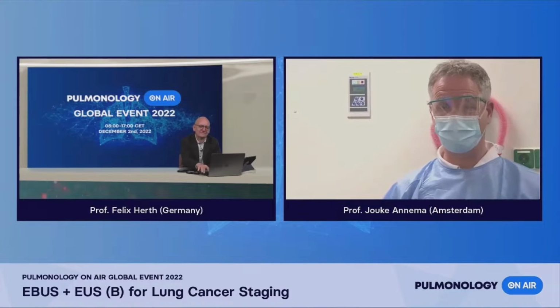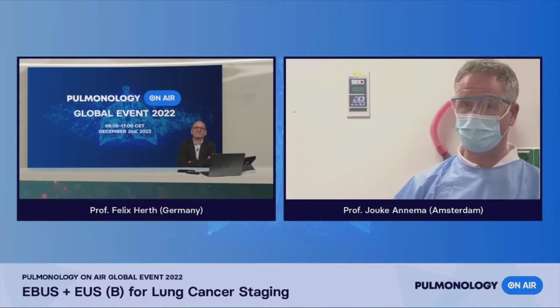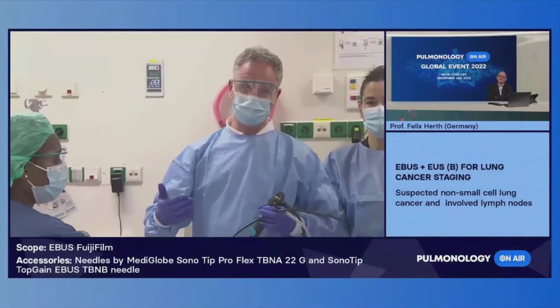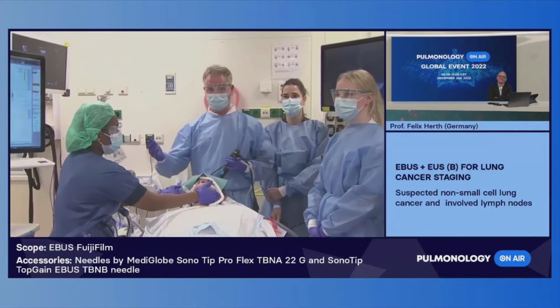This morning we will show you a combined EBUS and EUS-B procedure. But first, let me discuss the room setup. The patient is lying on his back, and I'll talk you through the room.